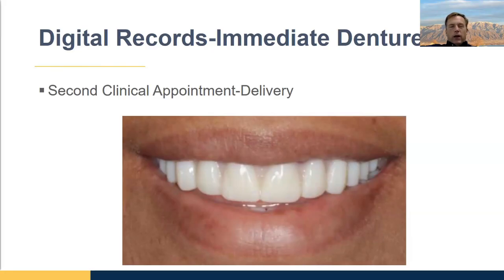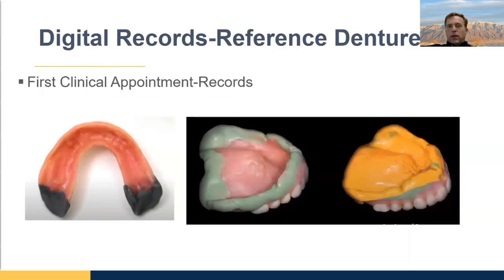So let's talk about the reference denture workflow. This is the best way to do a digital denture today. You get your patient to bring their denture, and you start out by making sure there are no huge areas missing on the borders. You can see a little bit of compound was added here. And then what we'll do is the same procedure.